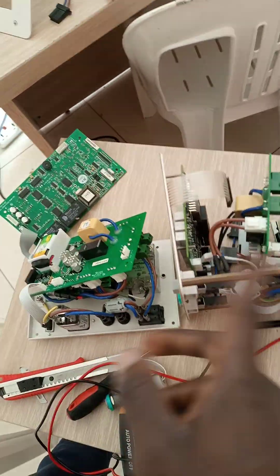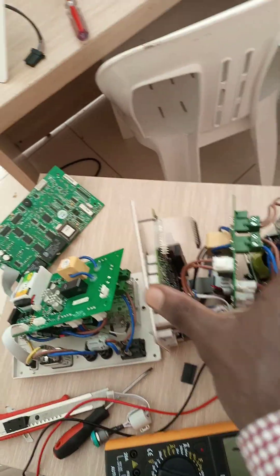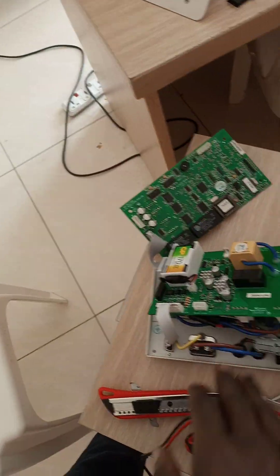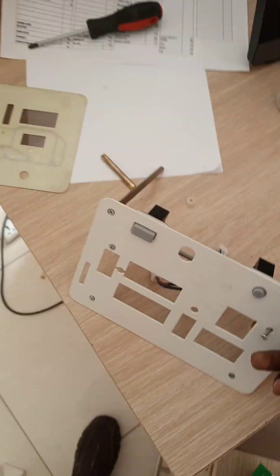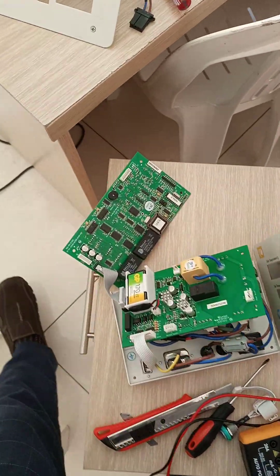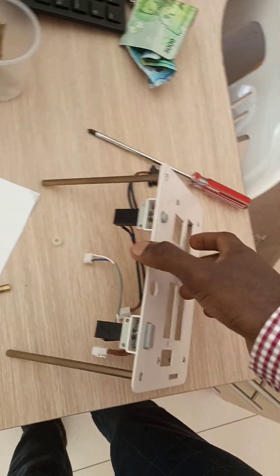I then swapped the display boards and the same result occurred — the functional machine worked and the non-functional one still didn't. This told me all three boards were fine. The problem had to be on the display panel itself, which I removed for further inspection.